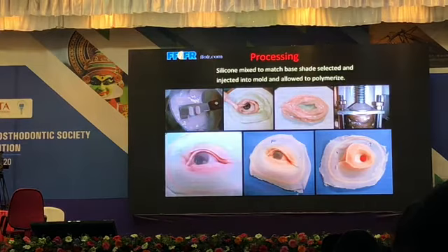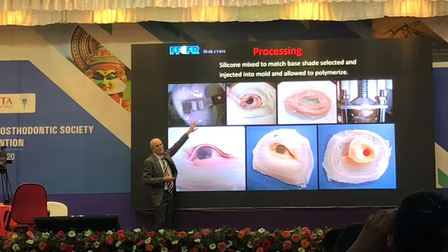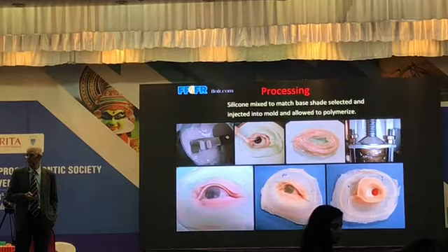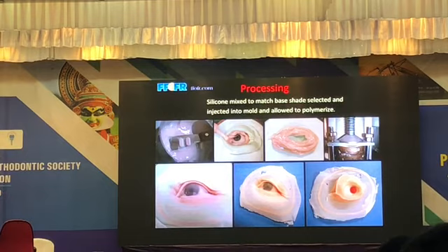And then, preferably, when you mix, you put this in a vacuum somewhere and get all the bubbles out. I know not everybody has a vacuum machine in their lab, so when you're mixing this stuff, you have to be careful not to incorporate too many bubbles in it. Otherwise, you have a porous material, and that can negatively impact the quality of the casting that you get.